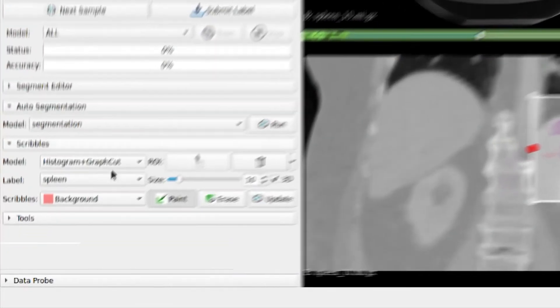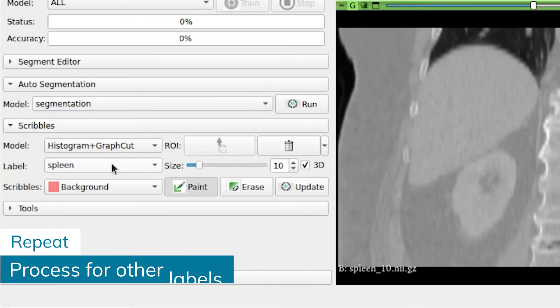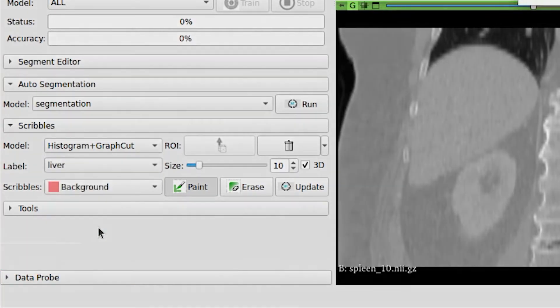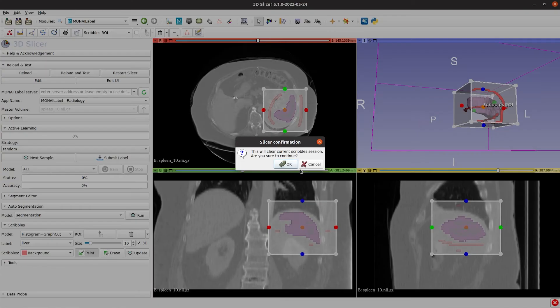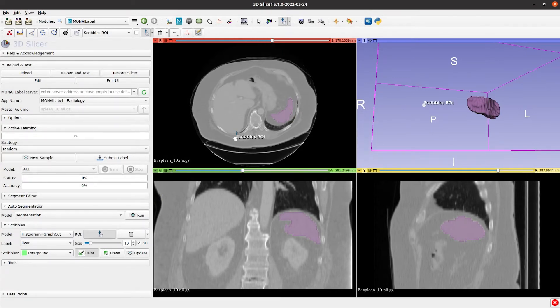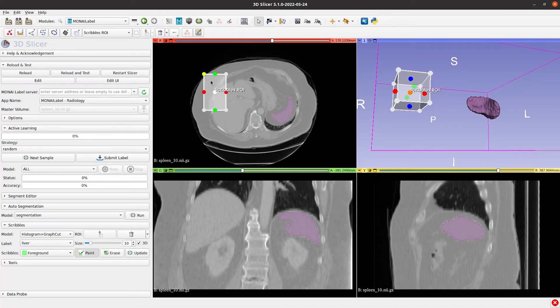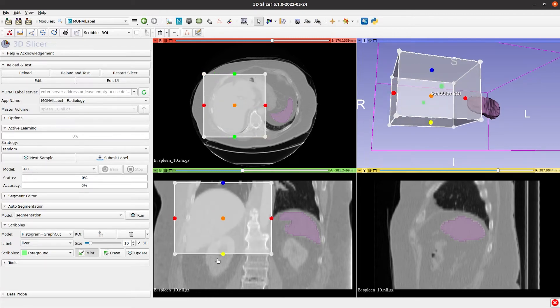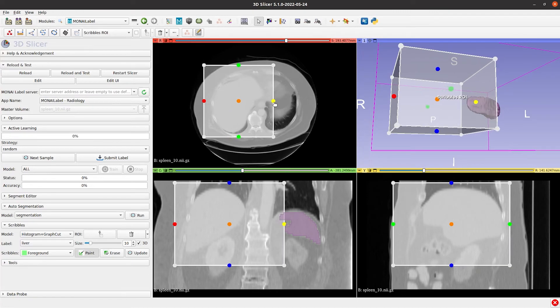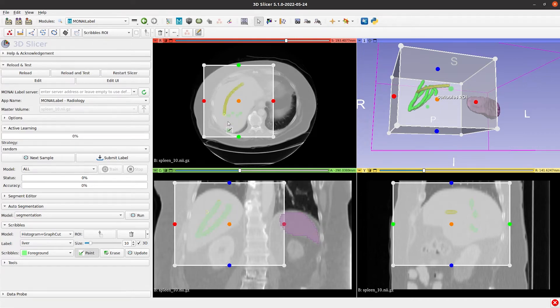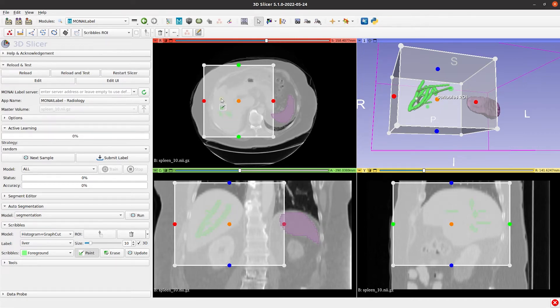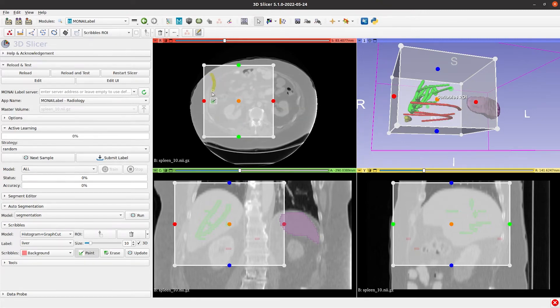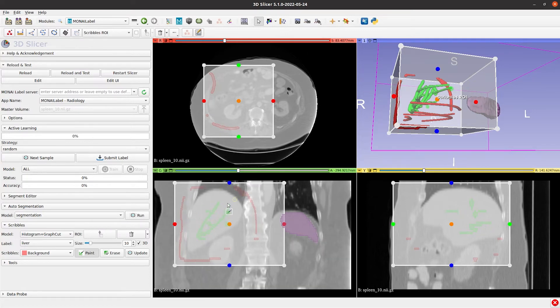Let's say, liver. There is no need to follow an order. Just create the labels you need. Again, the same process as before. First, add an ROI that covers the whole Organ in all views. Add the foreground Scribbles and then the background Scribbles. Click on Update to get the label.